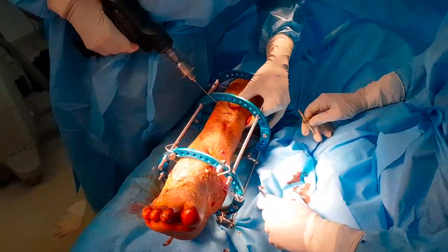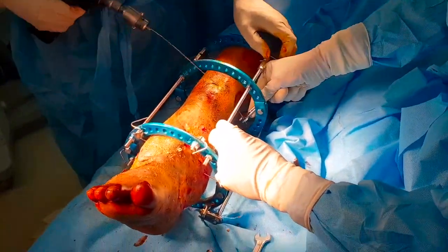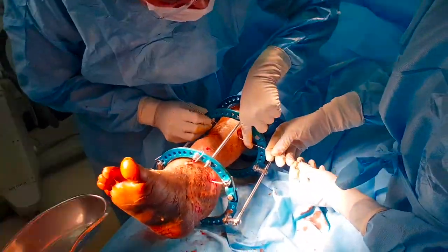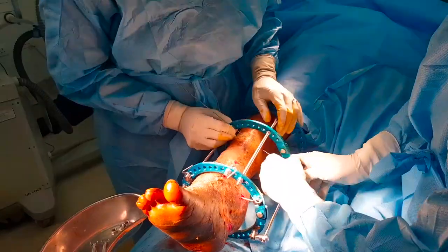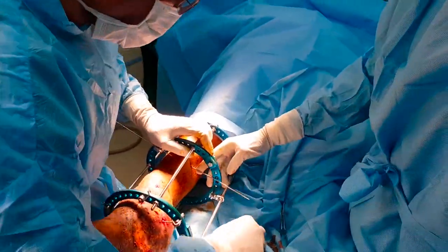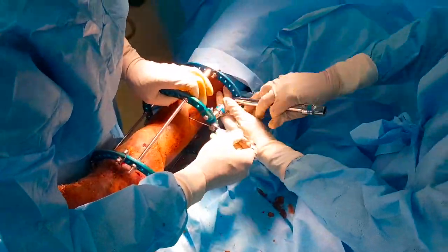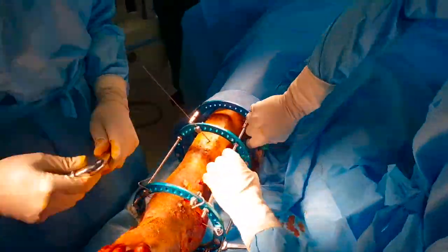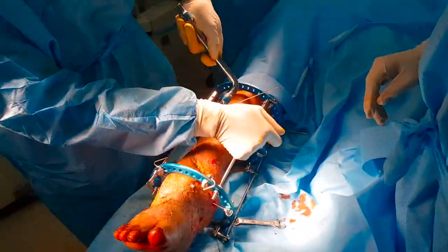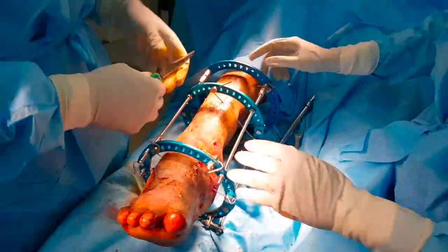The middle or transport fragment is impaled by the first wire, which is an antero-posterior wire passing only through the tibia through the safe corridor. One end is tightened and the nut on the opposite end is twisted to stretch the wire by winding it around the twisted nut.